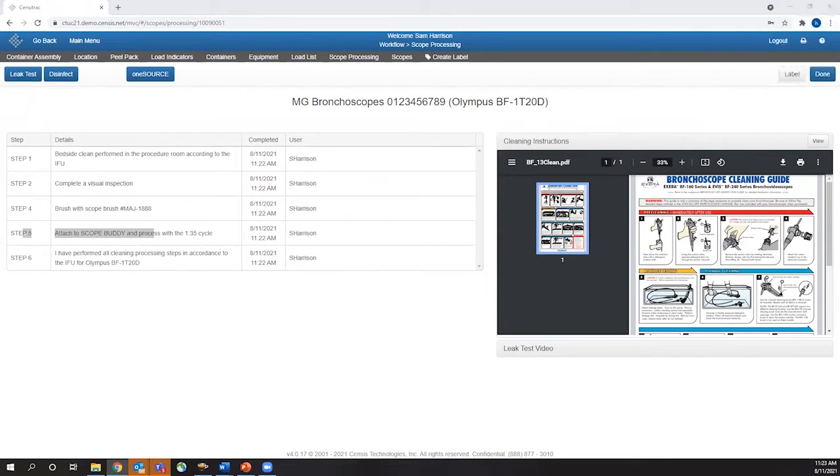Sam, can you hear me? Yes. This is exactly what I was asking about. I wanted to see if we could add this in decon, but also in prep and pack, because here we reprocess our scopes partly in decontam, of course, but also we bring them over to the prep and pack and we finish the HLD process here. Does that make sense? Yes, yep, I think so.